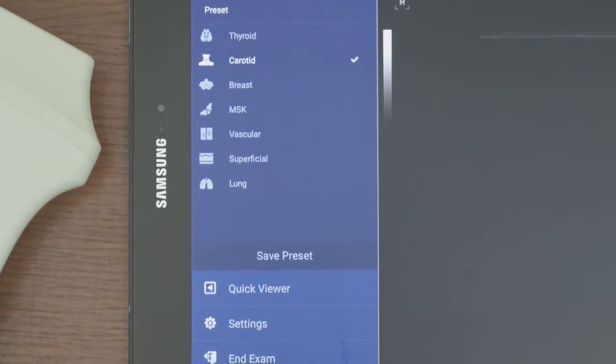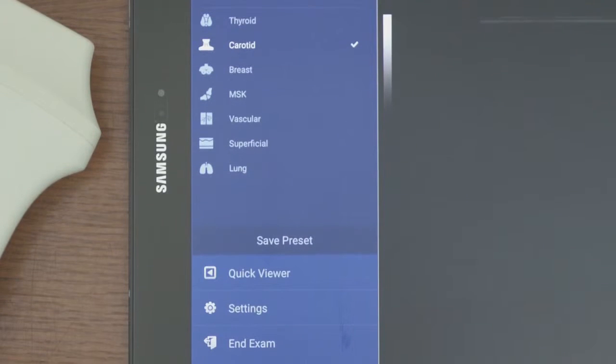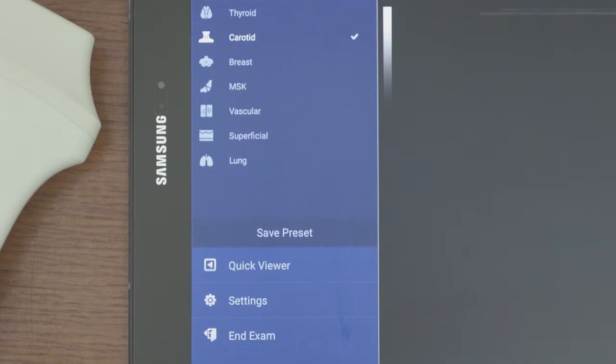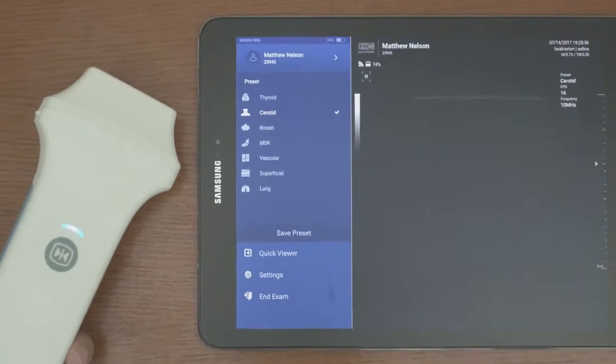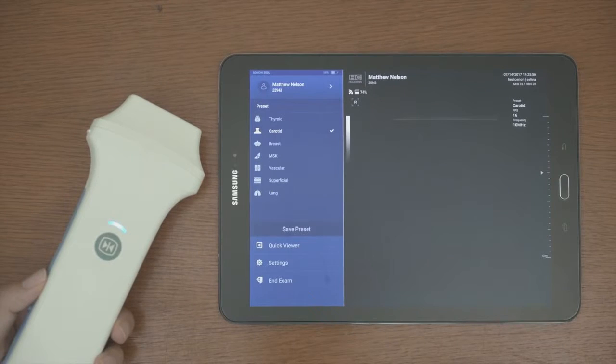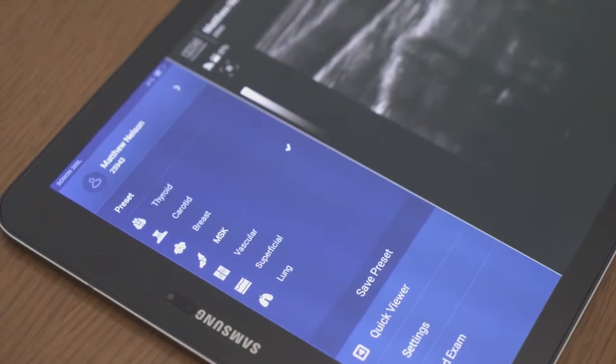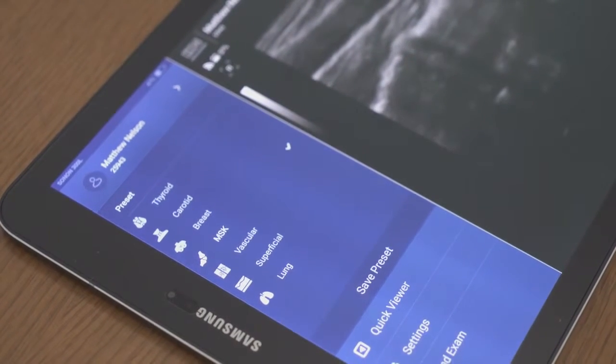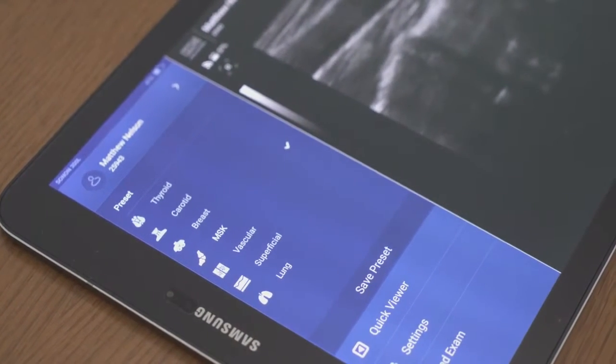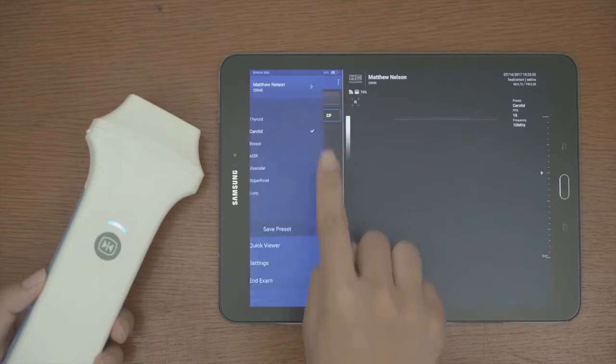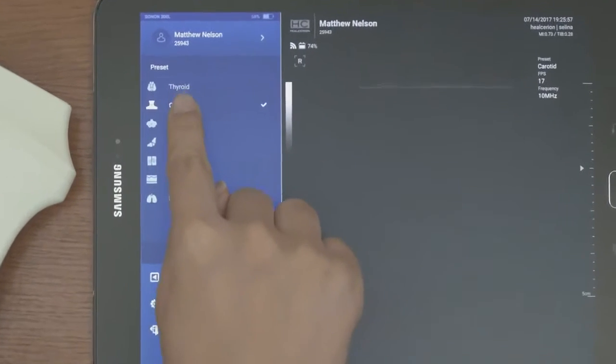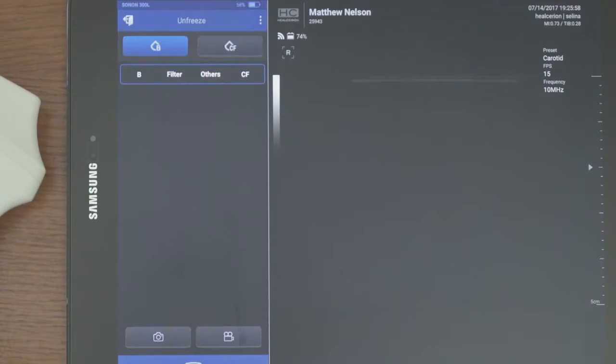Thyroid, carotid, etc. are preset for each part. Each preset can be changed according to user's preference and user preset can be created or changed. For example, I will set to carotid and scan it.